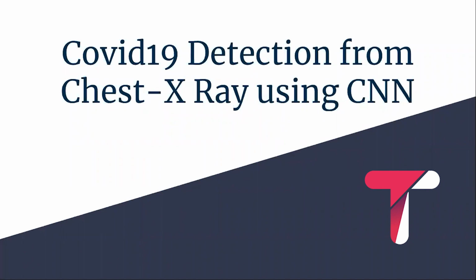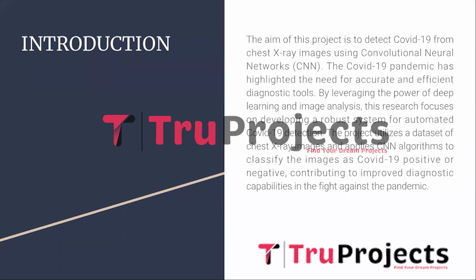Welcome to True Projects. In this video, we are going to explain the project titled COVID-19 Detection from Chest X-ray using CNN. The project is to utilize the convolutional neural network in order to identify COVID-19 cases from chest X-ray images. The significance of accurate and efficient diagnostic tools has become more apparent during the COVID-19 pandemic. The research aims to address this need by harnessing the capabilities of deep learning and image analysis to create a strong automated system for detecting COVID-19.